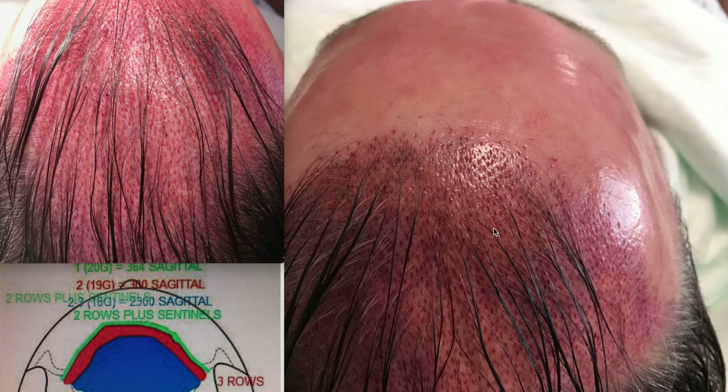The second thing I want you to understand is the hairs are all going straight forward. All the recipient sites are designed straight forward. I see too often the recipient sites going side to side, forward. If you don't design them in the right angulation, it doesn't matter how good your assistant team is, the recipient site design is going to limit the outcome.